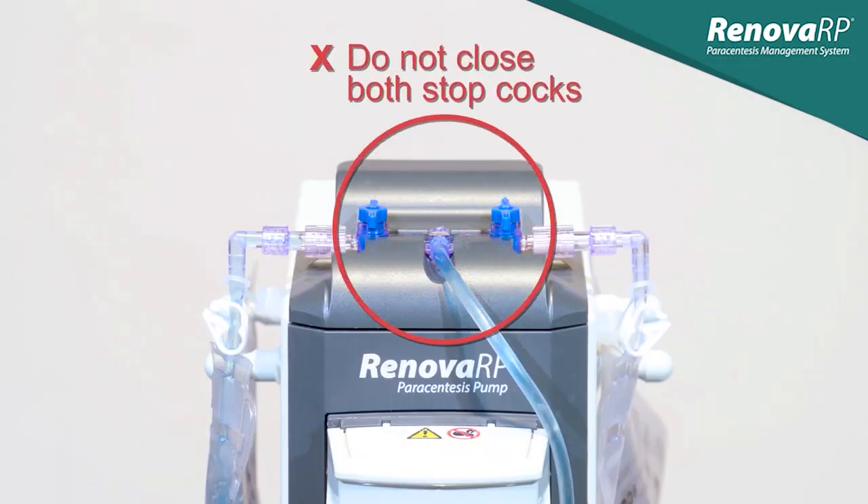One of the most important things to remember when using the Renova pump is to never close both of the blue stopcocks at the same time. Doing so can cause pressure to build up and put stress on the tubing, which increases the risk of fluid exposure.